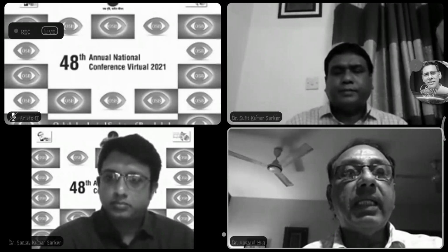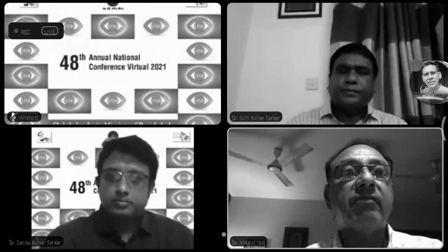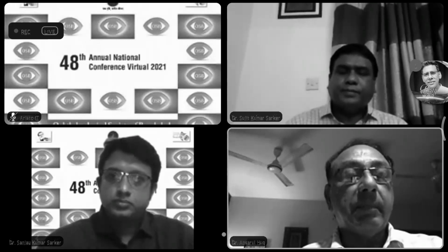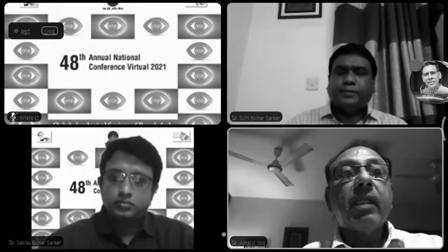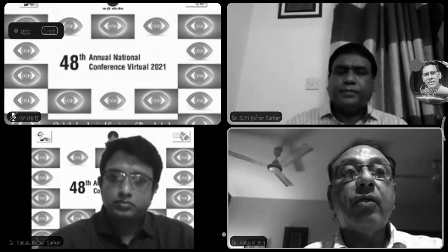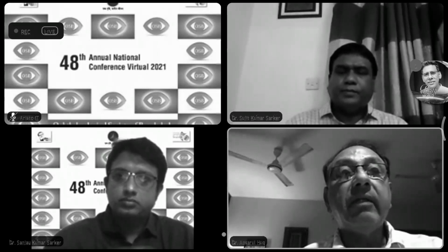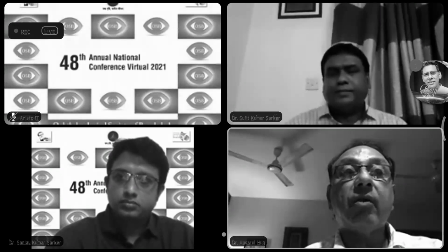Because that tells you about the leakages, the vascular patterns, the retinal vasculature pathologies, the normal retina, everything. But while it gives a good image of the retinal vasculature, it doesn't give much of the choroid.